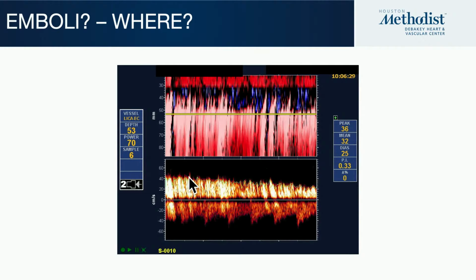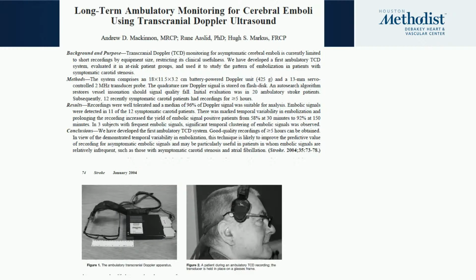But again, you study it. This is not in my blue, not on my arterial side; this is on the venous side. It's a non-pulsatile, beautiful signal, but again, you want to study the origin and which waveform those microemboli signatures are sitting in, and you see that this is not on the arterial side.